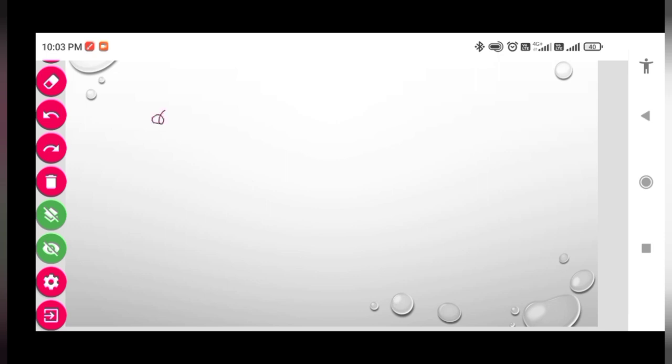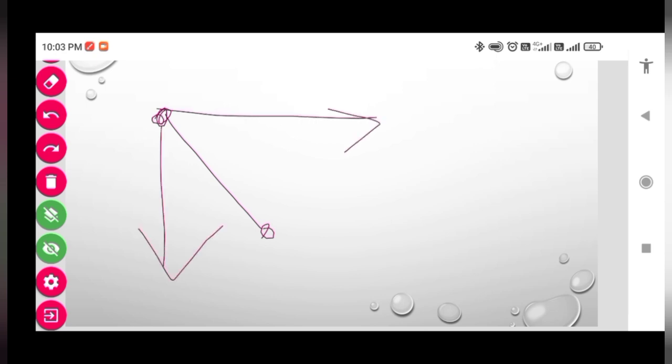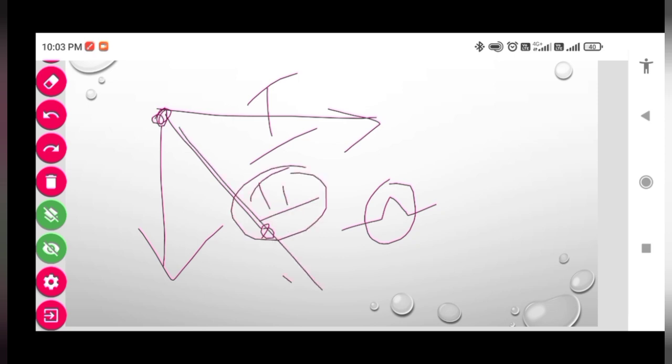So when the impulses travel from the SA node to the AV node, it has some horizontal component as well, along lead 1. So even in lead 1 there is some positive deflection, but it is smaller than lead 2. Why? On lead 2 there is a bigger positive deflection because the depolarization is taking place along lead 2, because it is the cardiac axis, right?